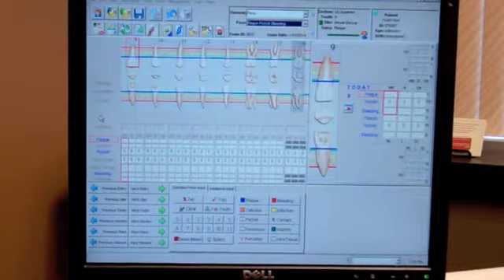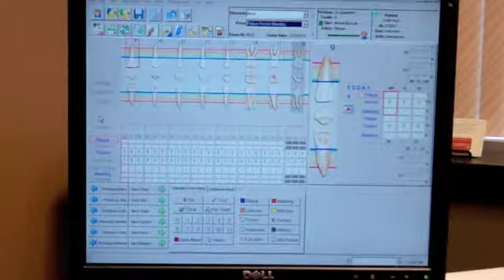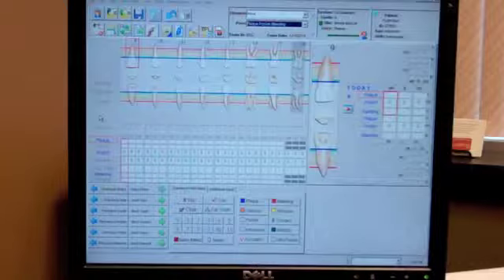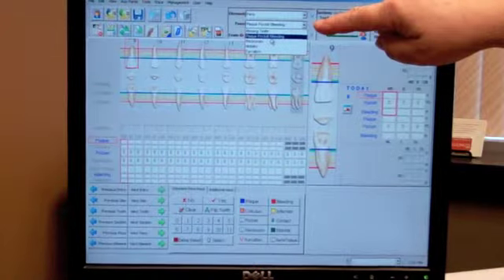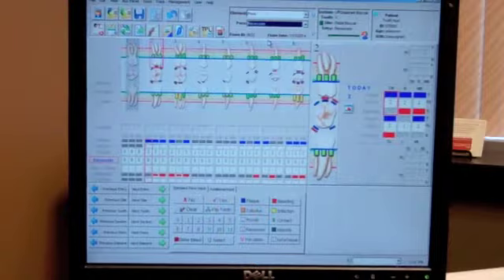So we are done charting the entire mouth. So we sit the patient back up and we show them their results. When we finish charting plaque, pocket, and bleeding, it will automatically switch to the next pass, which is recession.